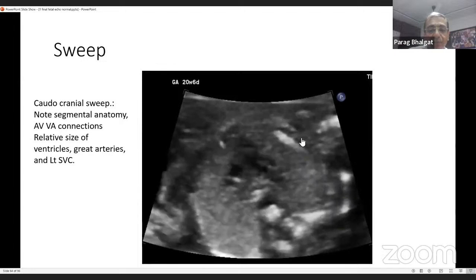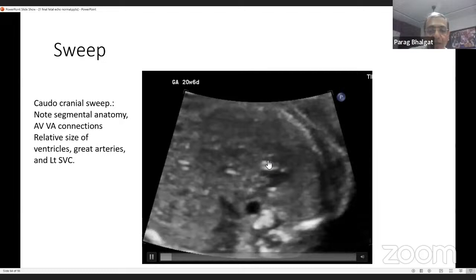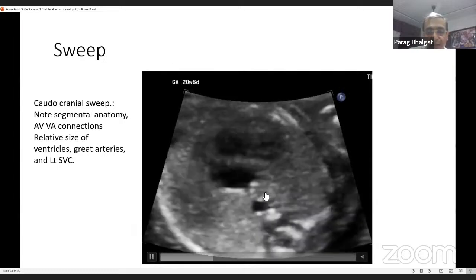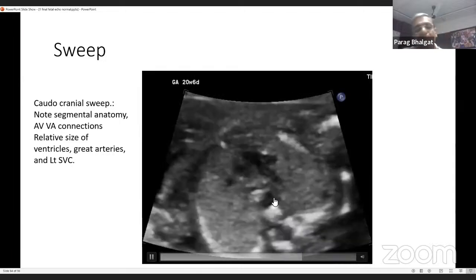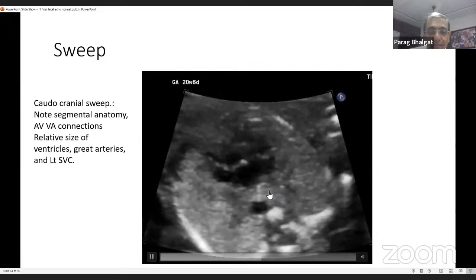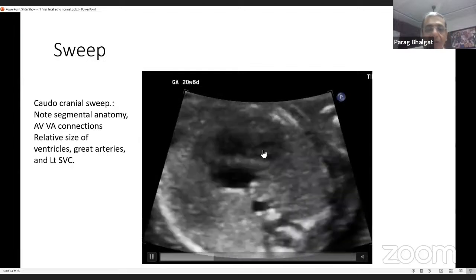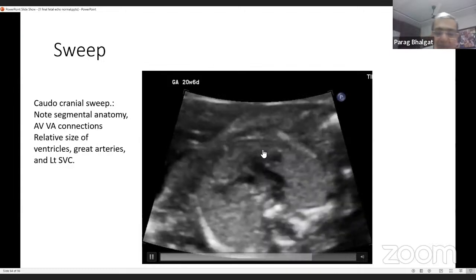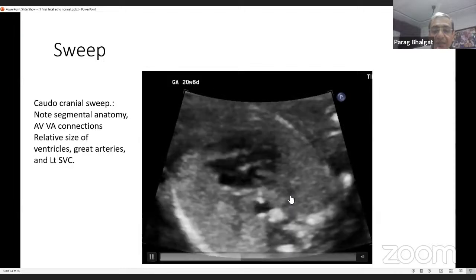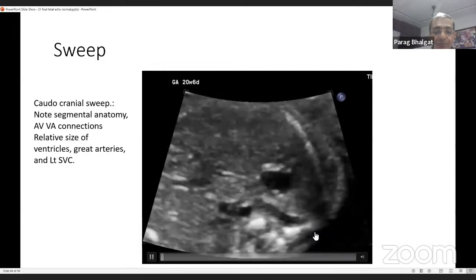Take a note of this strip. The aorta proximally, though LV is small, RV is dilated. The aorta distally suddenly tapers off after the first or second branch, where the MPA remains big in size. So note the distal tapering of the aortic arch. Otherwise, there is no appreciable VSD in this case. And the left SVC can be seen transiently here; this part is the left SVC.